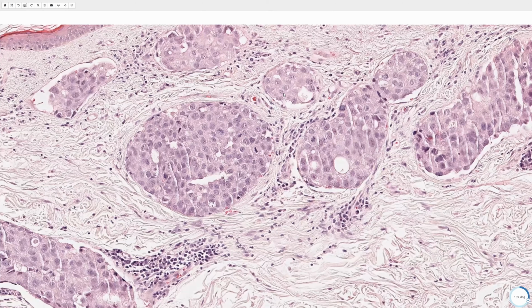So for the purposes of staging and prognosis, it's important to know the hormone status of these tumors. So if patients haven't had a workup within the last year, usually we'll check ER, PR, and HER2/neu. The breast tumors are usually also positive for gross cystic disease fluid protein, although that's a little more old school. EMA and CEA, though those are not specific for breast cancer, those will label other adenocarcinomas.